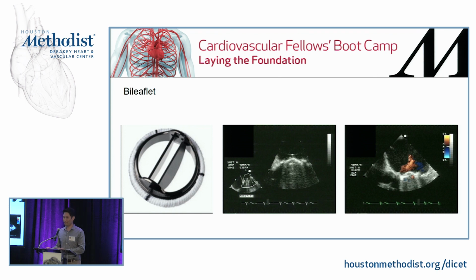So if you really want to get into it, you can look at the actual valve and talk to the reps and things like that and find out what the jets will look like.